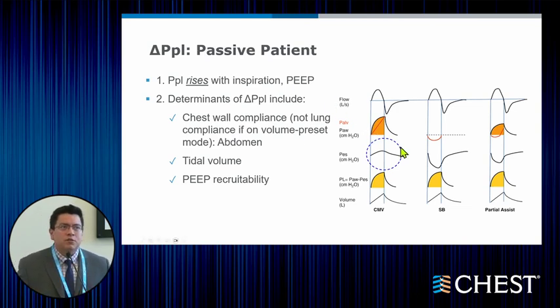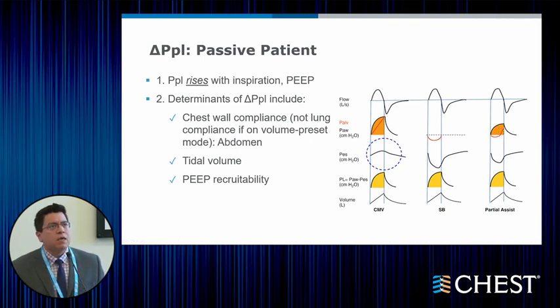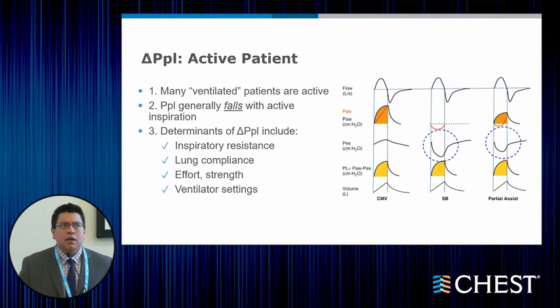As the patient starts to have full respiratory efforts, the esophageal pressure becomes negative, and you can see the effect on the alveolar pressure here, which is a reduction in that total alveolar pressure that you will see on the ventilator. And of course, if you have not as robust an effort, but just a partial assist by the ventilator, then you will see a reduction in that total pressure, but not too much of that kind of flow starvation that we're going to discuss later on.